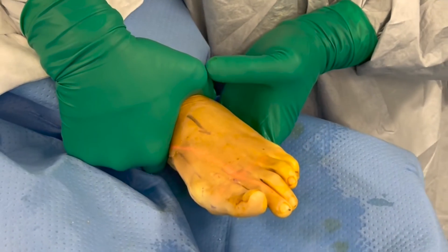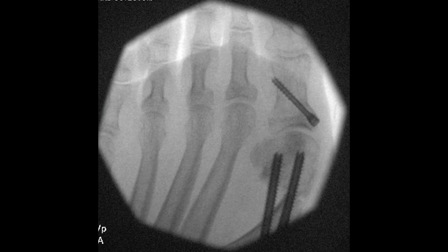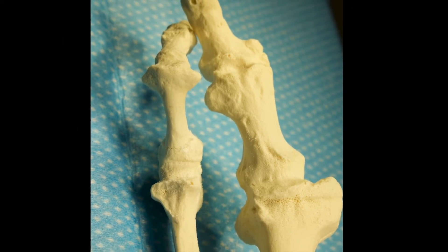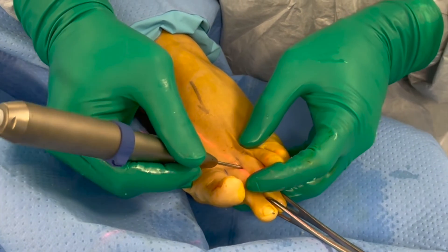This will result in the toe appearing straight. If needs be, further manipulation of the toe can be performed in order to ensure that the deformity is fully corrected. These fluoroscopy images and saw bone photos demonstrate the final position.